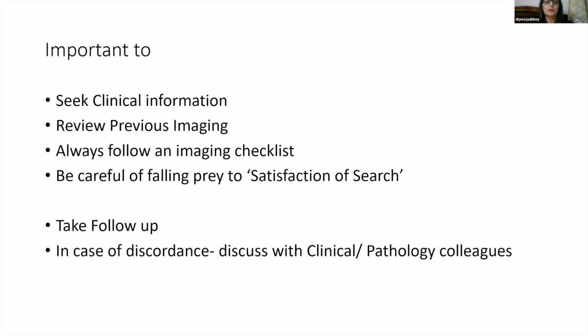So it's always important to be very systematic, and we should make our own approach or our own checklist. You can individualize your checklist, but always follow a systematic approach to reporting these chest cases. And also, for the sake of residents, I would like to emphasize that always try to take the follow-up, because that is how you will actually learn.